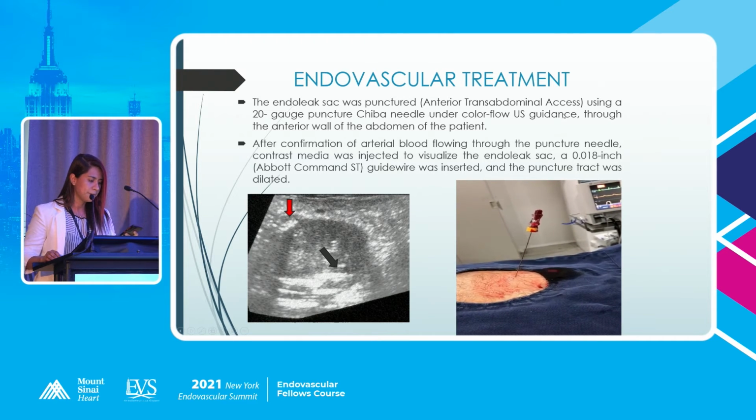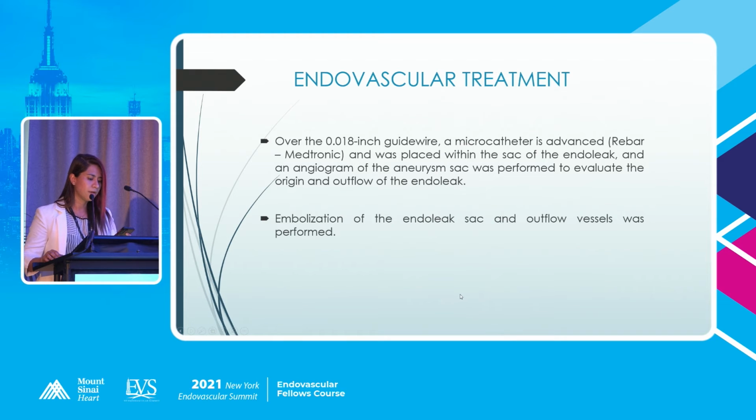Next, over the guide wire, a microcatheter, Medtronic, was advanced and placed within the sac of the endoleak, and the angiogram of the aneurysm sac was performed to evaluate the origin and outflow of the endoleak. Embolization of the endoleak sac was performed.